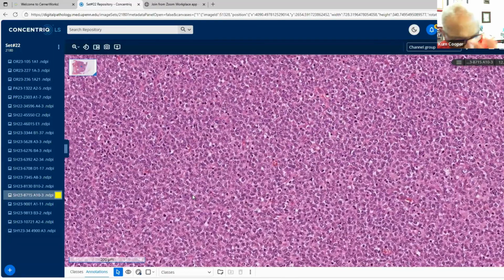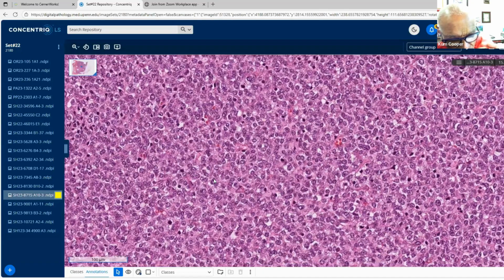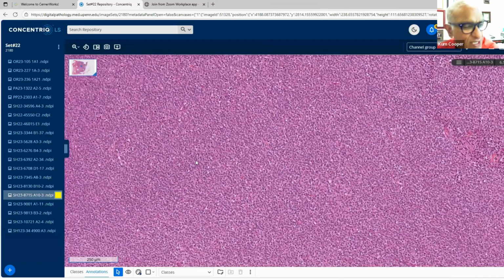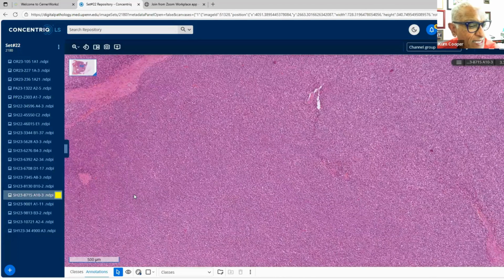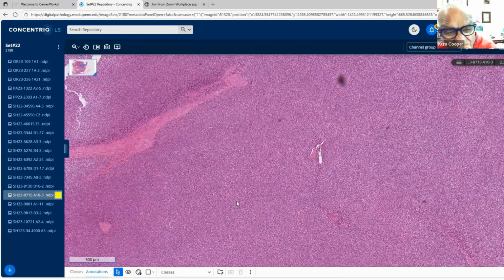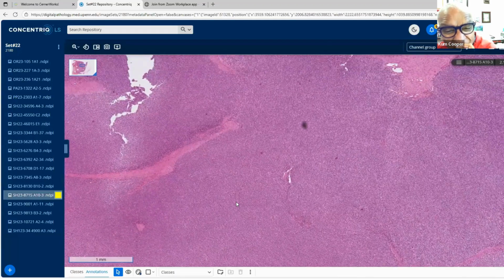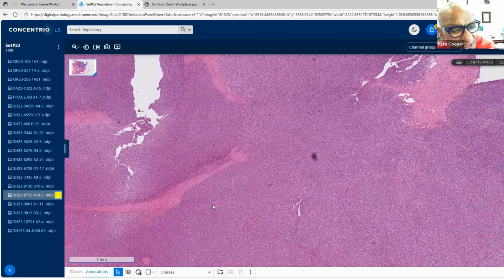And if you're concerned about that, the TFE3 is a good antibody to start off. It should be nice nuclear positivity and diffuse. That can be difficult to interpret, so be careful of that. There's a seminoma here. Okay, we have to think of all possibilities. And that's a good thought, given the cytoplasmic membranes and the clear cytoplasm.